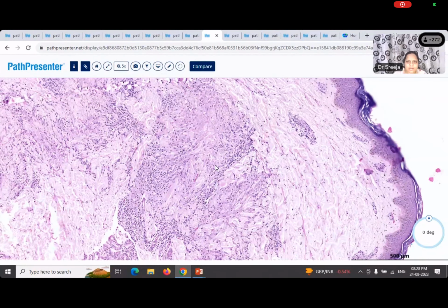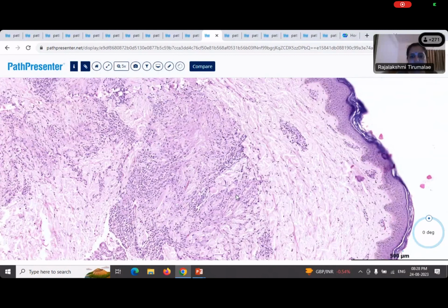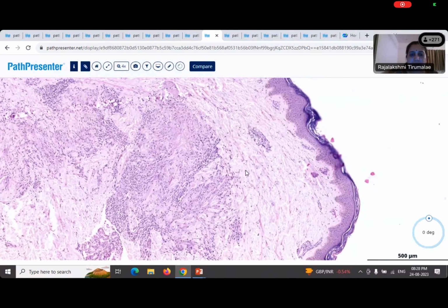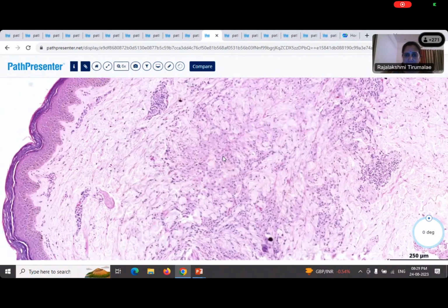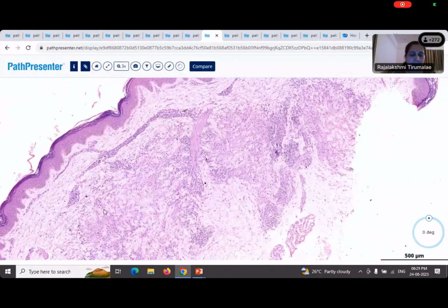Interstitial type of inflammatory infiltrate. Okay, is this the interstitial pattern I'm showing you, or something else? The one in this field, how would you describe this? There is something in the center, and you have this sort of a fence around it. What would you call this pattern? Palisading. Yes, you're right. So this is a palisading pattern. There's something in the center, and there are cells surrounding that. And as you rightly said, this is also an interstitial pattern, so you see this infiltrate going in between the bundles of collagen. So here again, you can see a palisading pattern and an interstitial pattern.